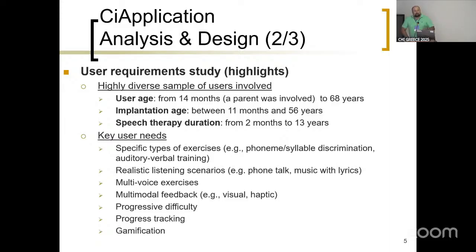They asked for realistic listening scenarios. For example, I want to be able to listen to sounds on the phone or music with lyrics. Multi-voice exercises, many people talking at the same time. Multimodal feedback, progressive difficulty of the exercises, progress tracking, and they didn't say gamification, but they said, I wanted it to be fun, I wanted to stay engaged, stuff like this.